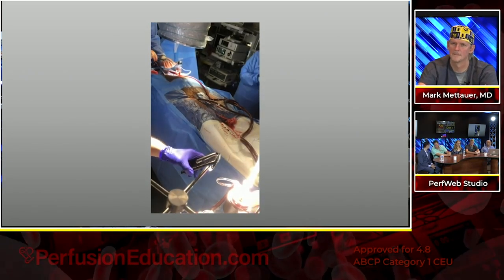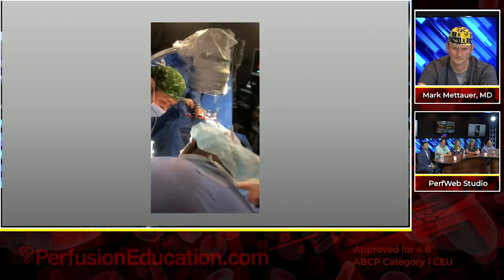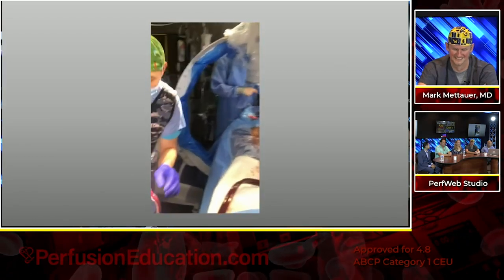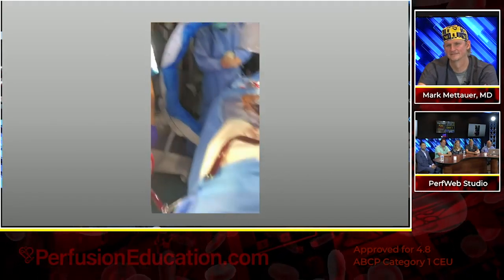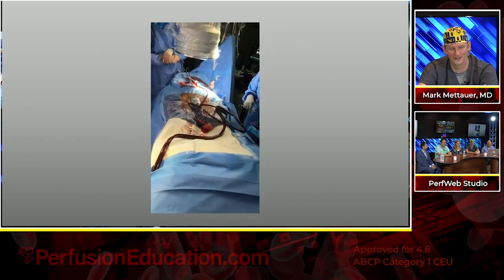I see material in the trap. Right there, I see it. Okay. Yeah. Yes. I think we just sucked it out. So you never had the flow wrong. Correct. The flow's right. We never had the flow wrong. We had it on. I thought you said on. Well, I thought you said wrong. Not wrong.